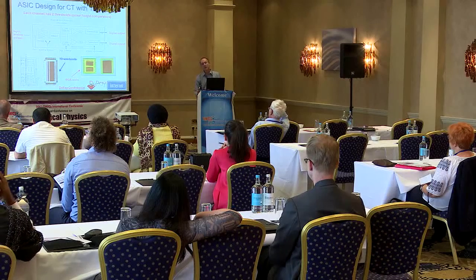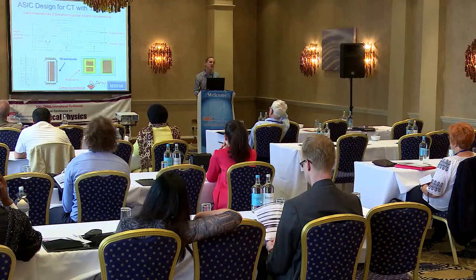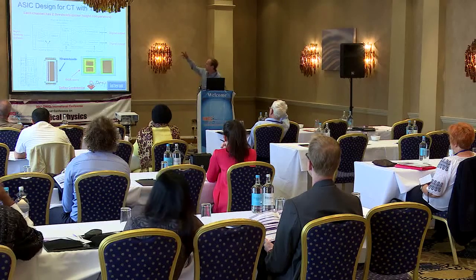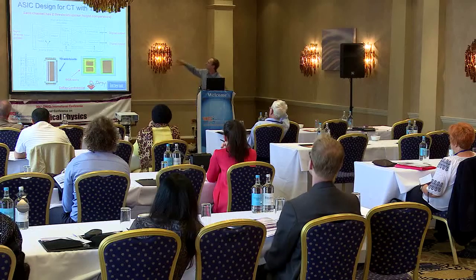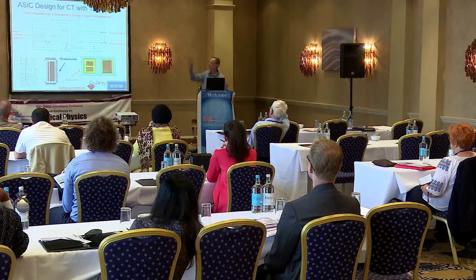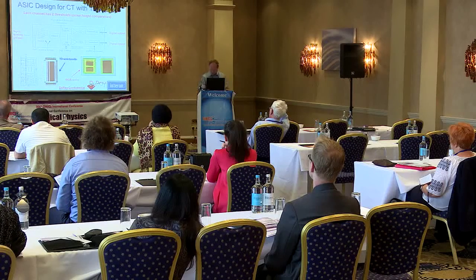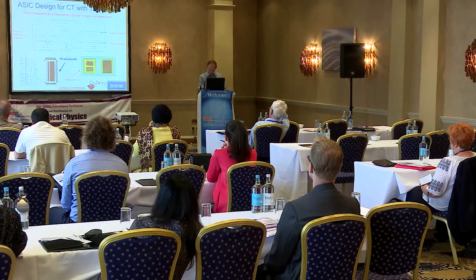And so taking a look at the technology for CT, the first system was made using two energy thresholds, which means that this is going to be capable of counting each X-ray and binning them into two different energy bins, a low and a high energy bin. So you can see the schematic diagram of the circuit, and this was implemented in silicon, in an ASIC, and packaged inside a ball grid array here, as shown here.